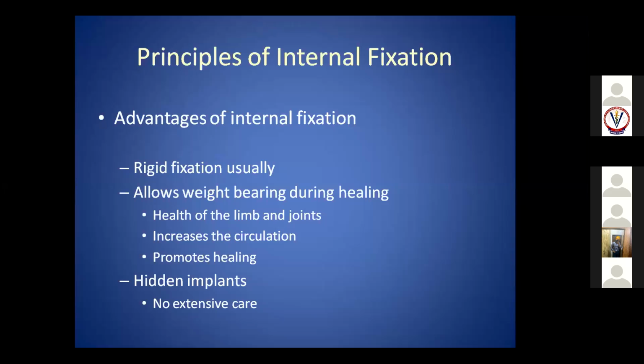So when you are opening the fracture site and using an implant, an implant is nothing but a device that will help you to attain fracture healing. So implants can be of many types.